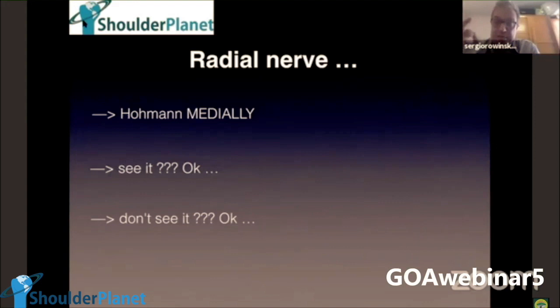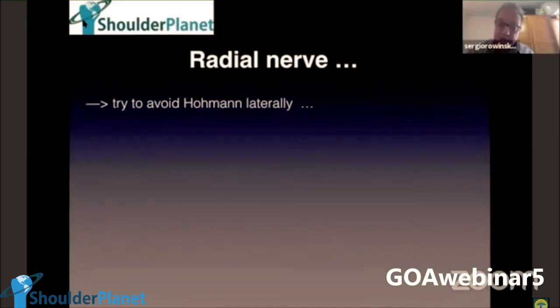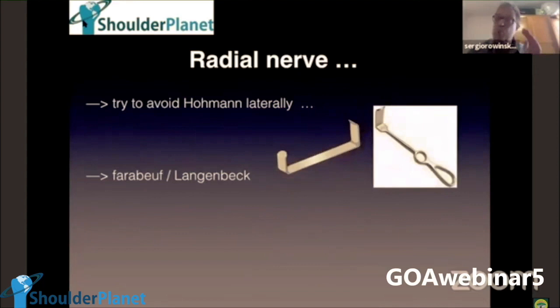But I need to have space. I need to have space to work. So that is traction, a Hohmann medially. Try to avoid the Hohmann laterally, to not damage the radial nerve, but sometimes I do it with a lot of delicacy. But before that, try to have space, a Hohmann medially, a Farabeuf or a Langenbeck, taking a lot of care with the radial nerve.